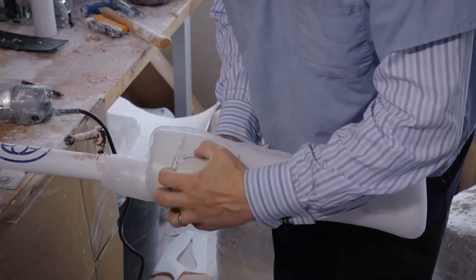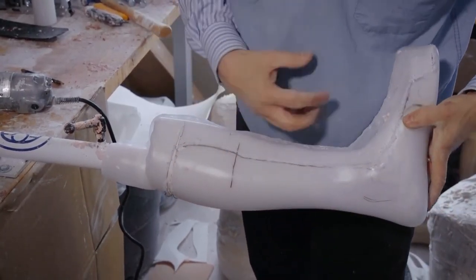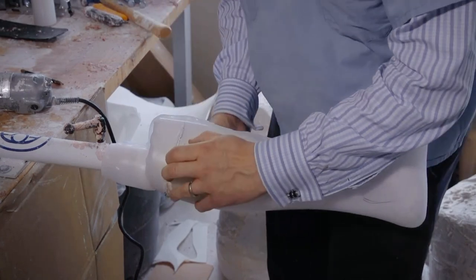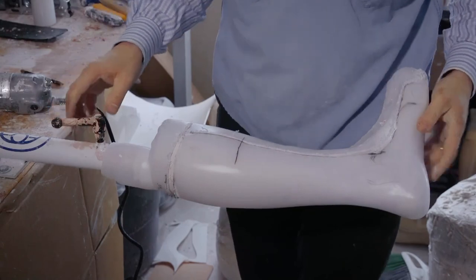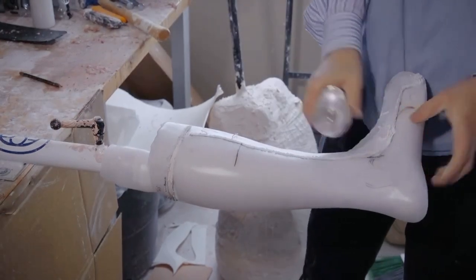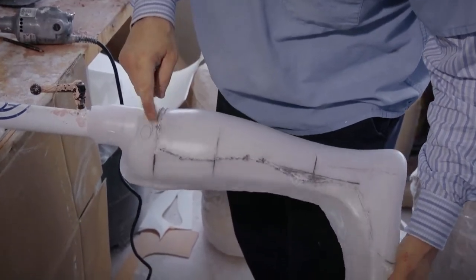Everything looks pretty good here. If one little spot's connected, it'll hold the whole thing together still, so we don't want to crack anything. Let's just have a look-see here. That looks like that's fairly well separated.